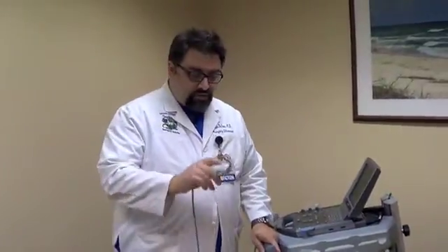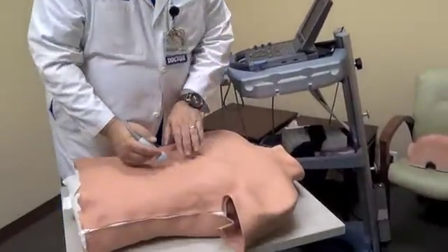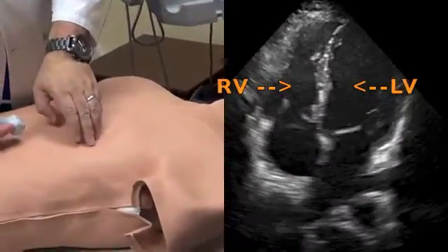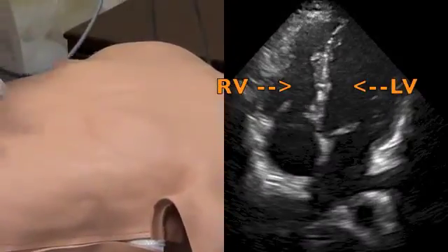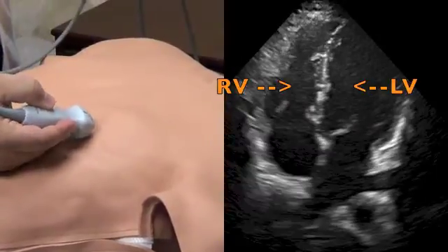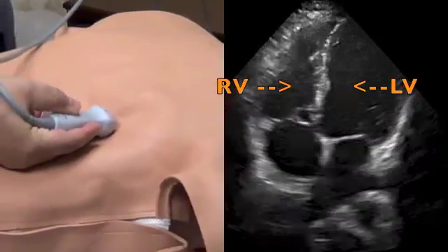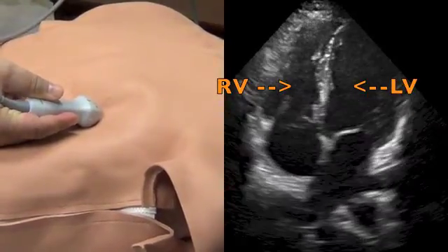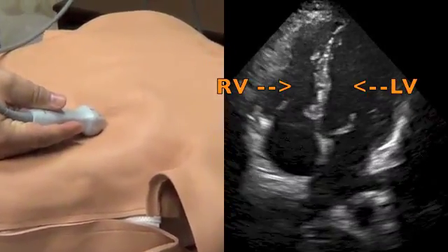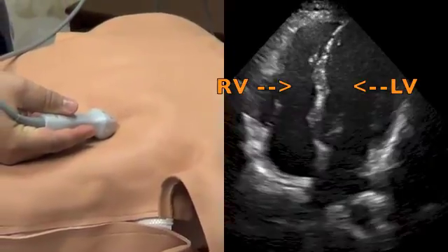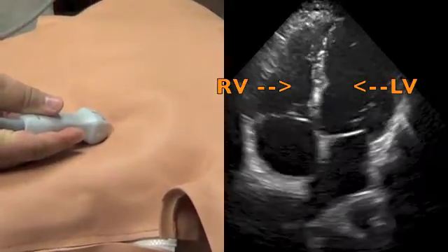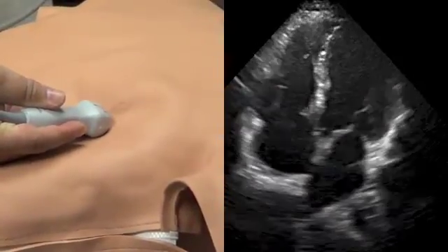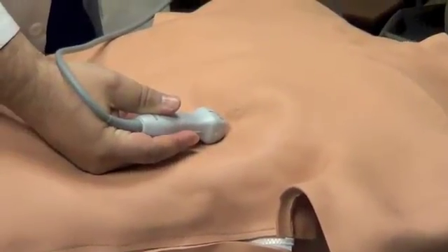Now we're going to do the apical view. You should be more or less at the level of the precordium — mid-clavicular line at the fourth or fifth intercostal space. You want to put your probe pointing towards the base of the heart. You should be able to visualize the four chambers: on the left side of your screen you should have the right atrium and right ventricle, and on the right side of your screen the left ventricle and left atrium.